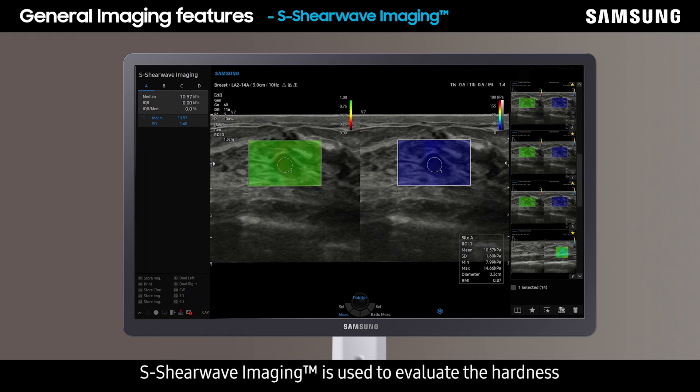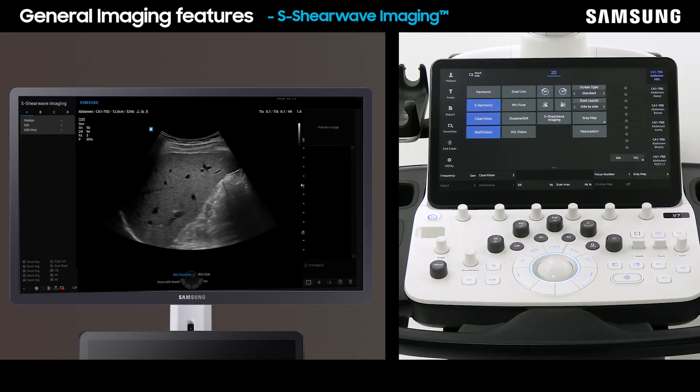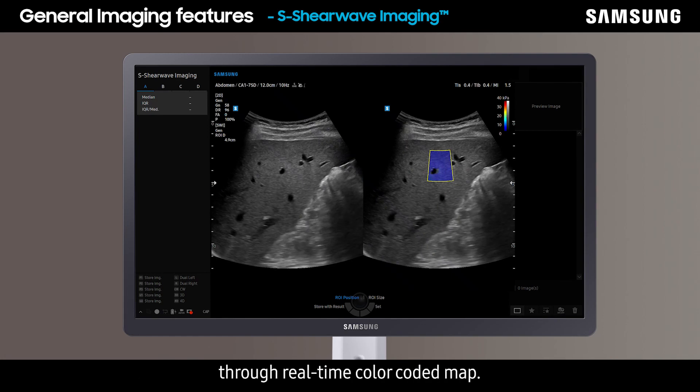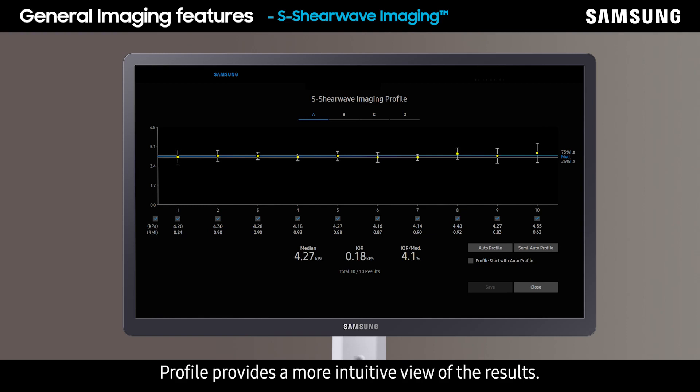S-Shearwave imaging is used to evaluate the hardness of tissues and organs such as the breast and liver. Breast exams are used to diagnose benign or malignant cases, and liver tests are mainly used to diagnose and observe the progress of cirrhosis. To activate S-Shearwave imaging, select it on the touch screen. Qualitative evaluation of tissue hardness can be analyzed through a real-time color-coded map, and this function also comes with quantitative results. Profile provides a more intuitive view of the results.